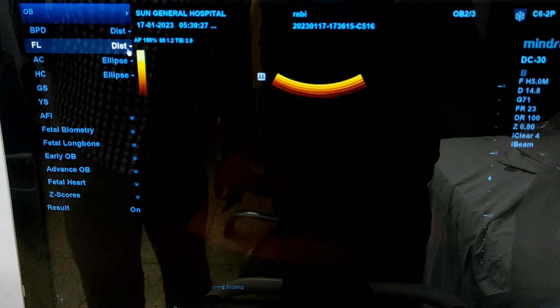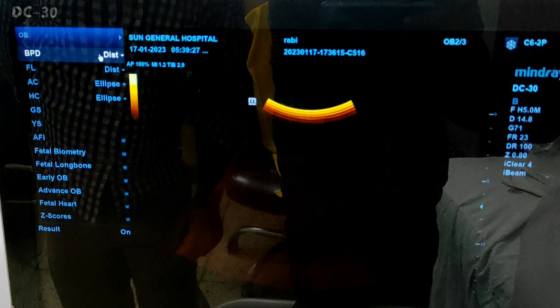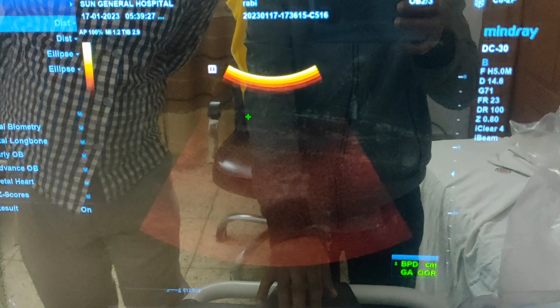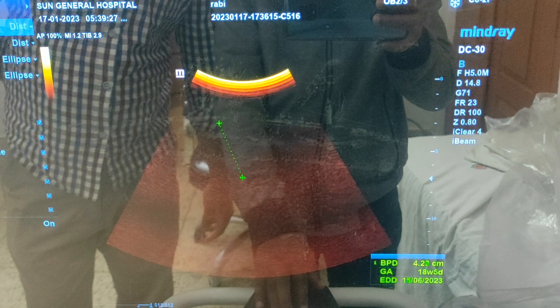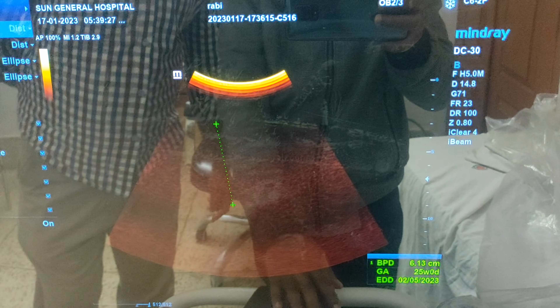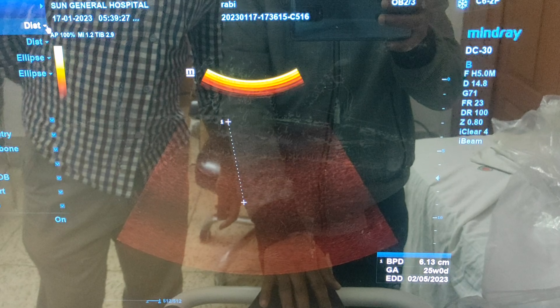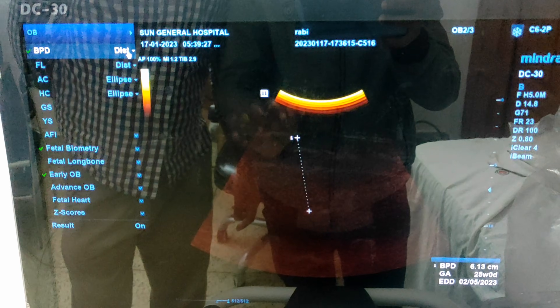To measure a specific parameter, first you have to select it. When you select it, a plus icon will pop up. As I select BPD, one plus icon appears — that means measuring has started. Click one point here and another point here, then press enter. The BPD distance is shown in the lower right corner of your screen.